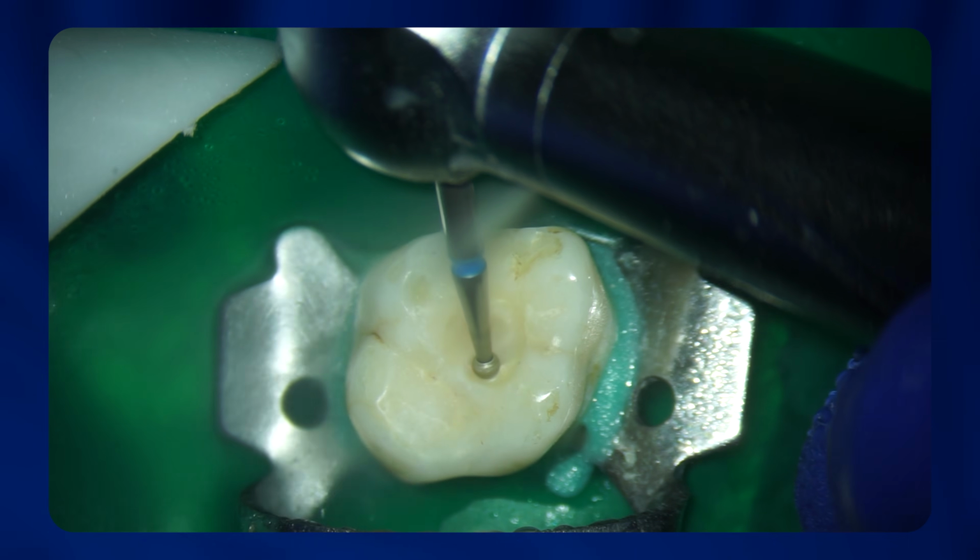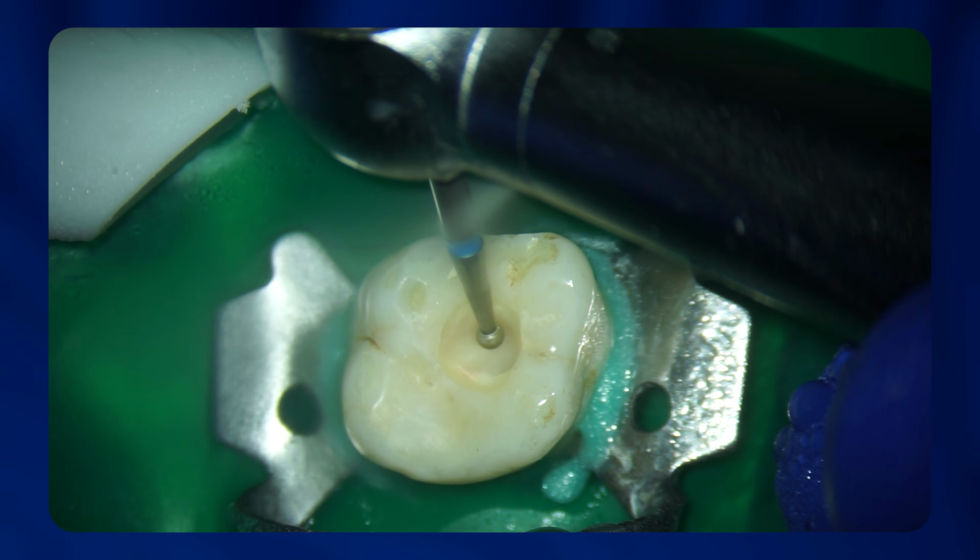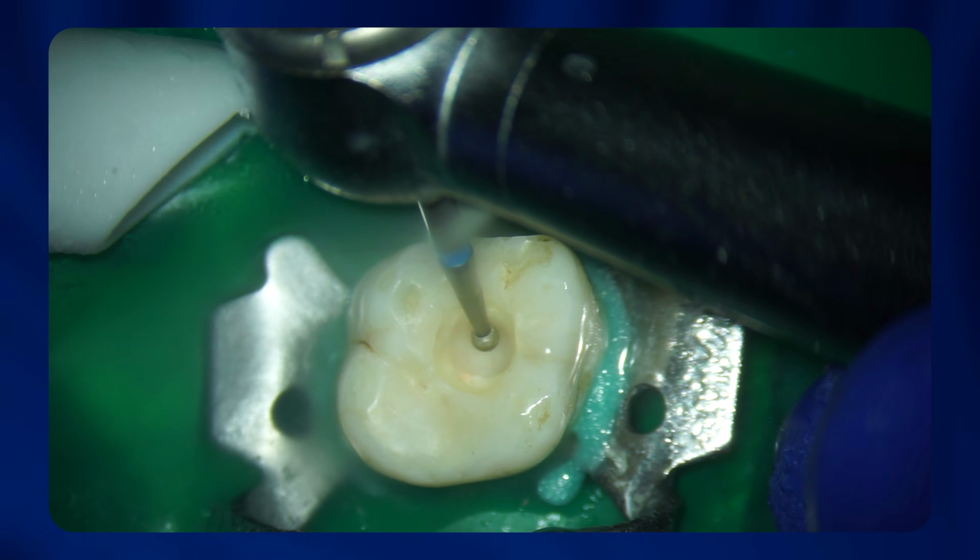So here's what we do when we go back into these teeth, when we see these patients for the appointment to complete the process. When the patient comes back, you can look at the glass ionomer. The glass ionomer is hard, so it doesn't respond to ultrasonics. So we need to use a burr to remove the harder glass ionomer on top. You can see me using a burr, and we remove the glass ionomer. And once the hard glass ionomer is removed with a burr and we reach the Cavit inside, the Cavit can be easily removed by using ultrasonics.